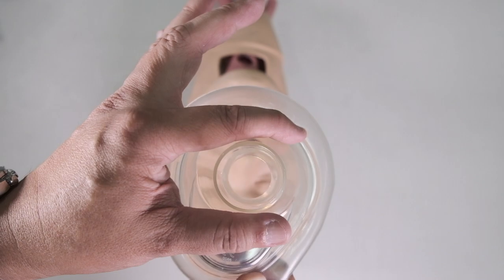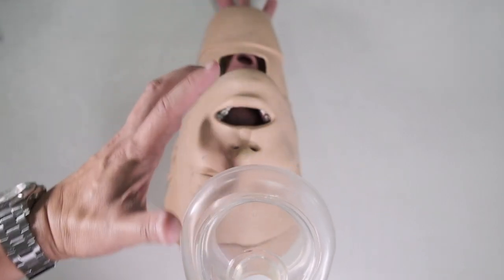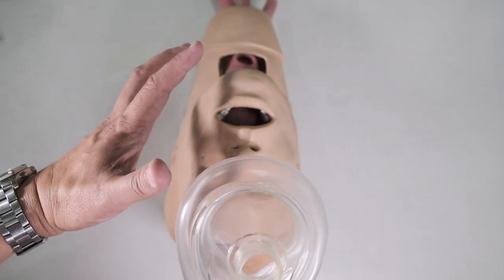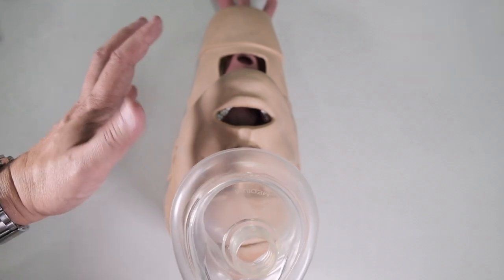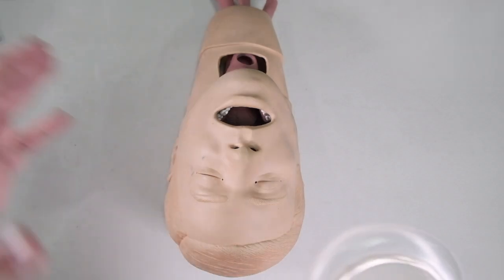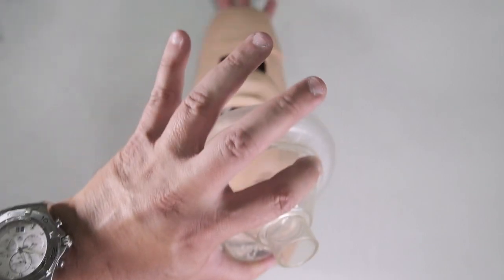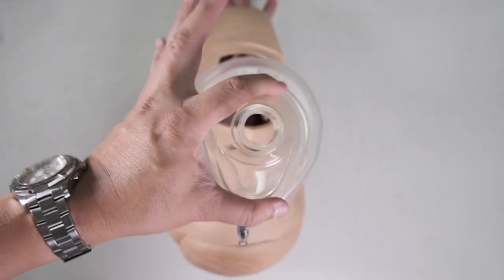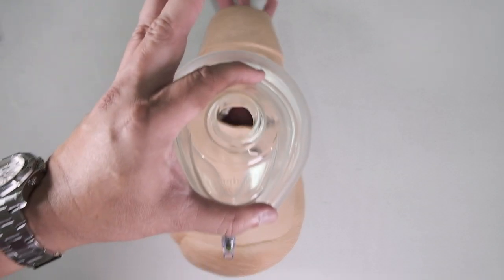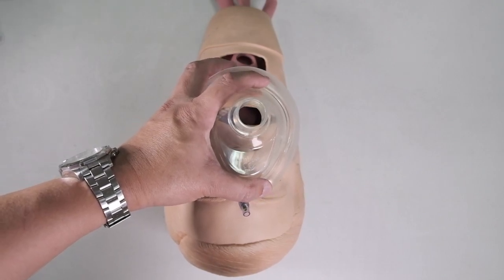So you press down, this one goes up. You lift the chin up, you lift the mandible up. So you're actually trying to simulate the sniffing position. So to demonstrate, again, the C grip, the E grip to the mandible. The nasal part, the mandible part, and this is how we put the mask on the patient.